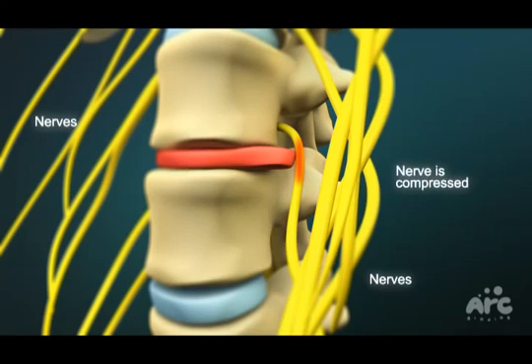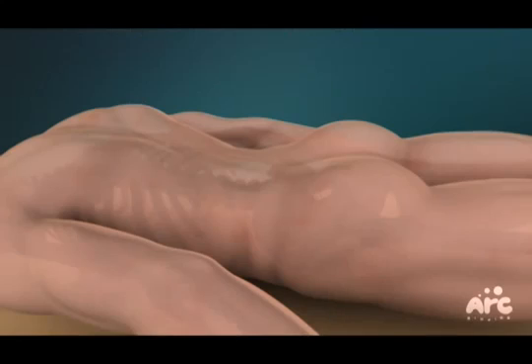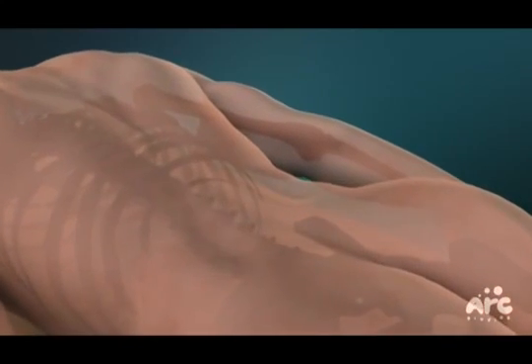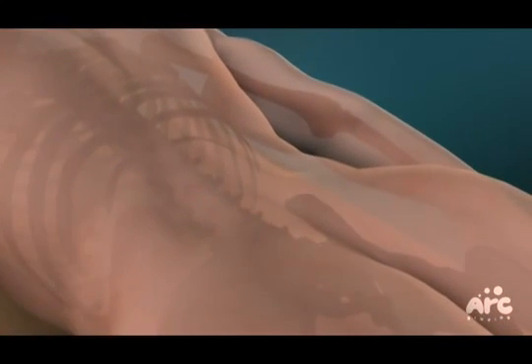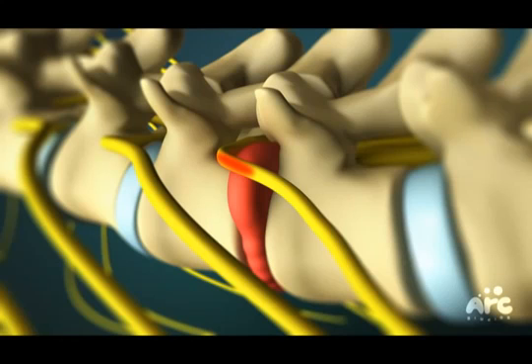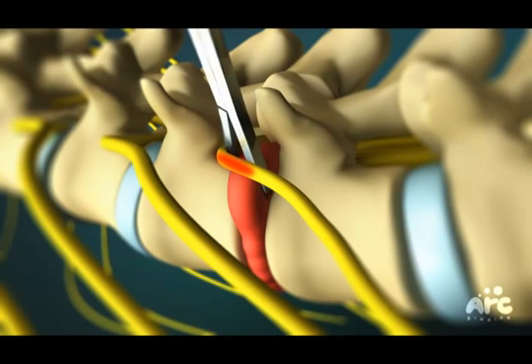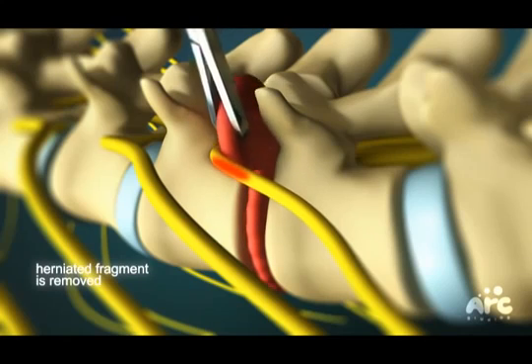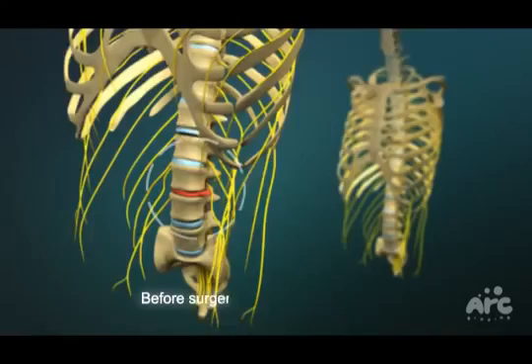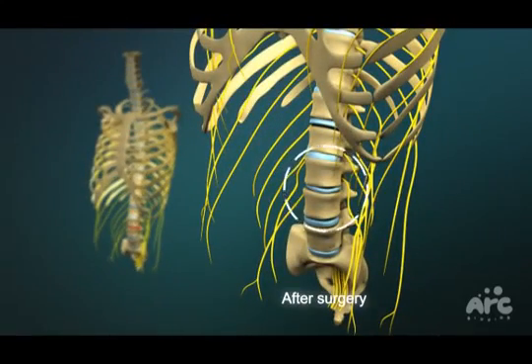The surgical treatment of herniated disc is discectomy. In order to remove the fragment of the herniated disc, a surgeon will make an incision over the center of the back. A small amount of lamina bone and ligament around the herniation is carefully removed. Once this bone and ligament are removed, the spinal nerves are protected by removing the pressure around them.